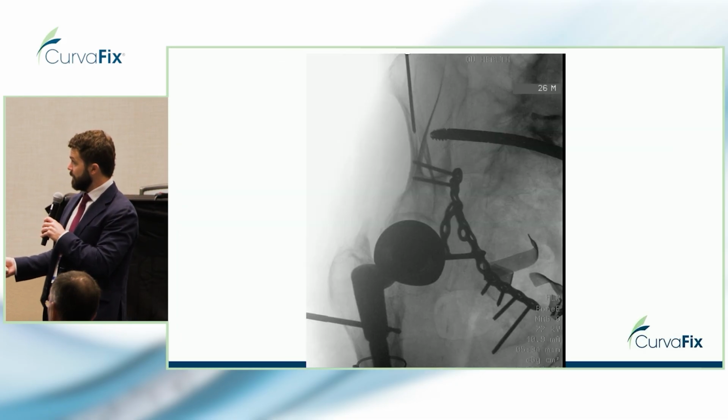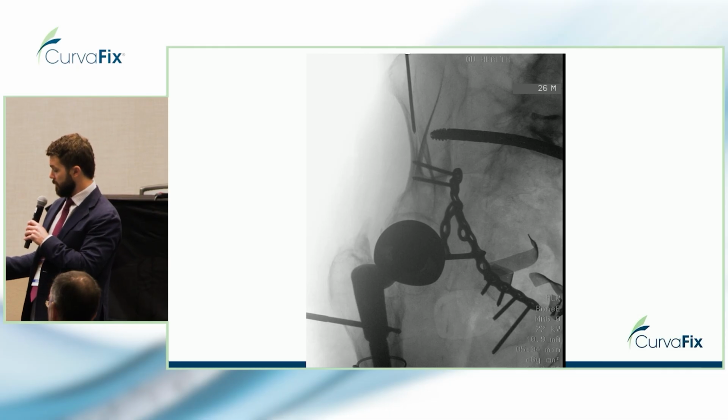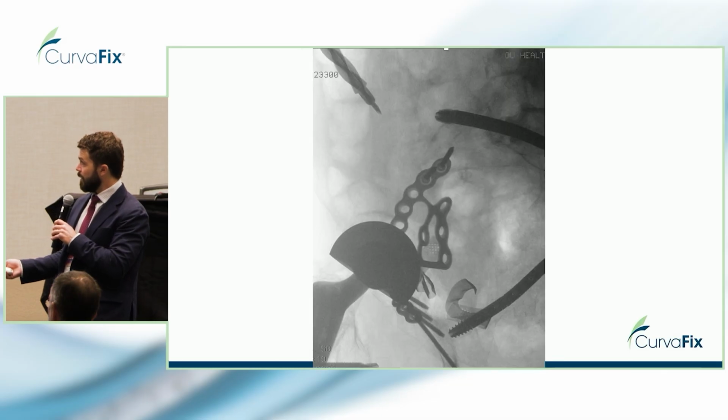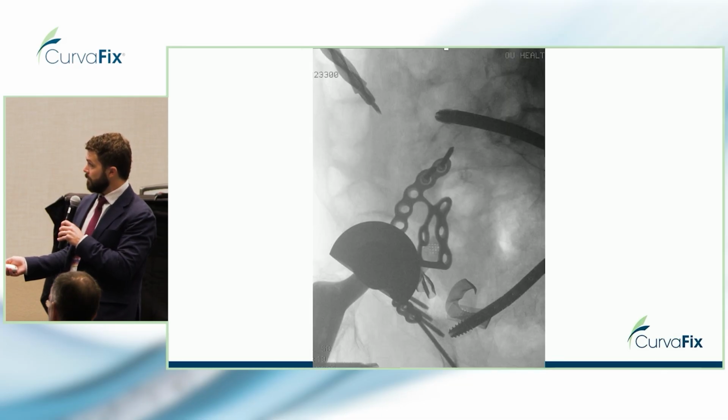so you can prevent insulting the muscle bellies themselves. Here's an example of the obturator oblique outlet where you can see you're in between the inner and outer table of that gluteal pillar after your entry guide wire and then entry reamer. And then here, on the iliac oblique, ensuring that you're at least heading towards in between.